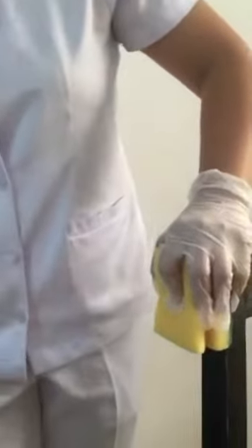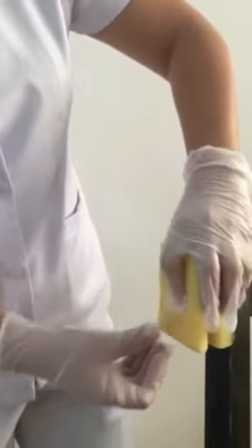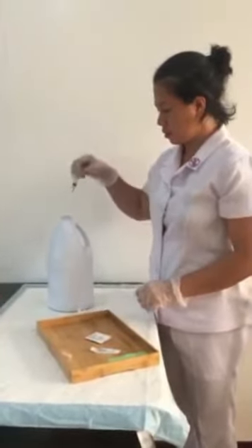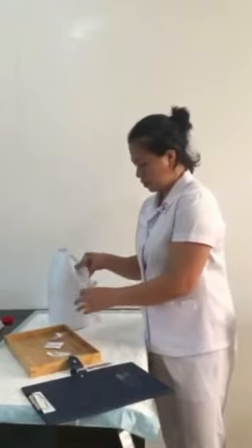If bleeding occurs, apply pressure with dry sterile gauze until it stops. Activates the needle safety device or discards the uncapped needle and syringe into the proper receptacle. Removes and discards gloves and performs hand hygiene. Documents all relevant information: the time of administration, drug name, dose, route, and the client's reactions. Assesses the effectiveness of the medication at the time it is expected to act.